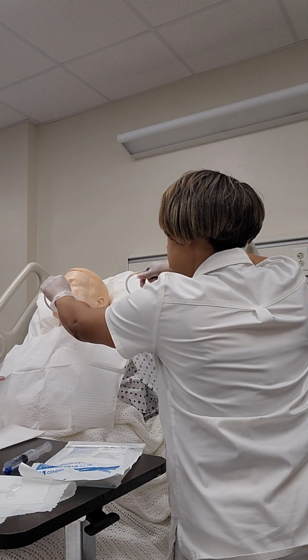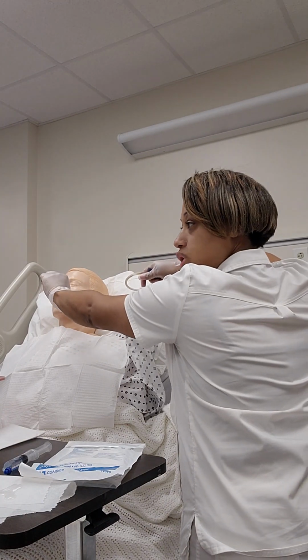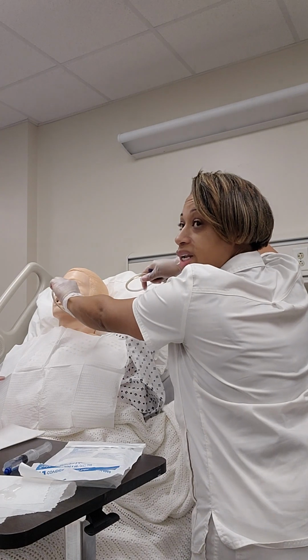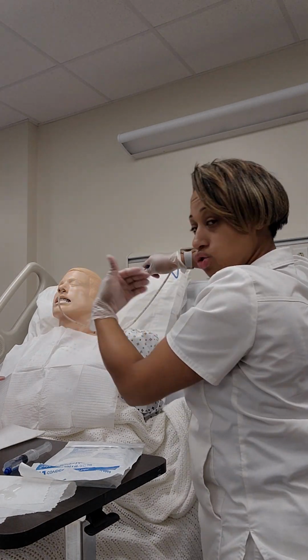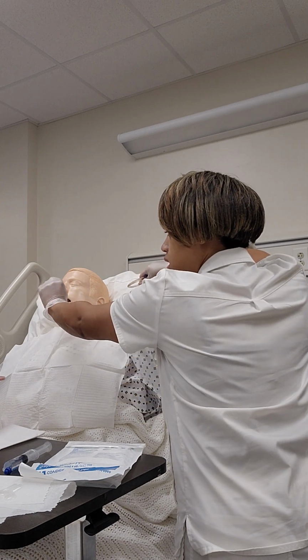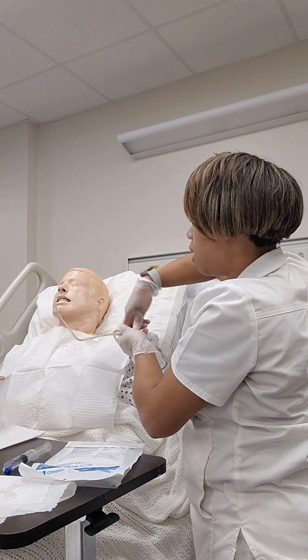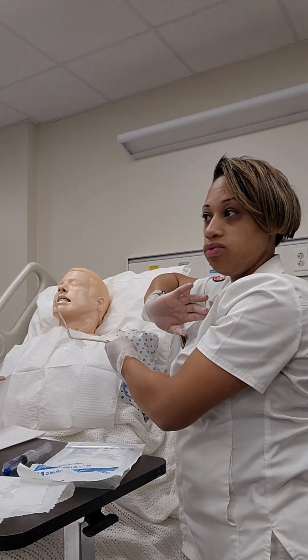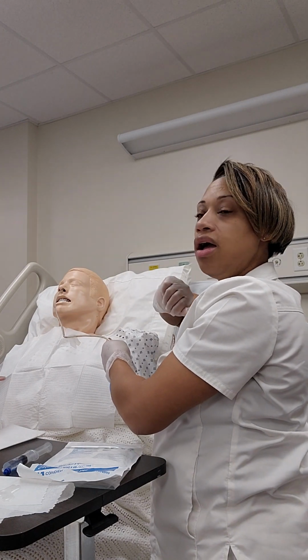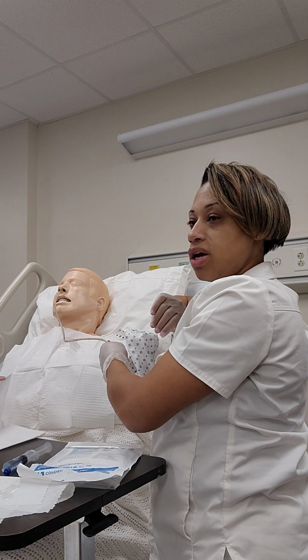As I insert the tubing downward and backwards, I will maneuver it down, and instruct the patient to put their chin to their chest and swallow as I insert the tubing.